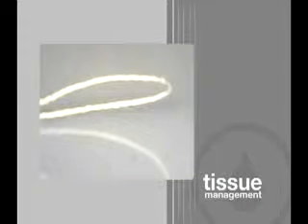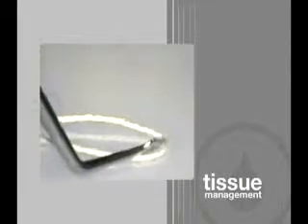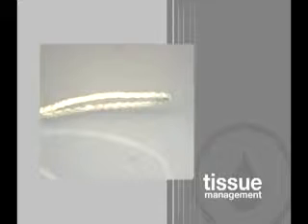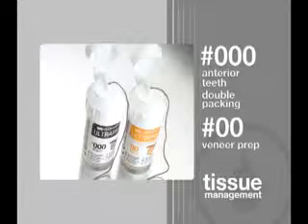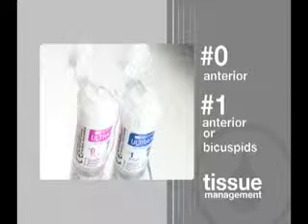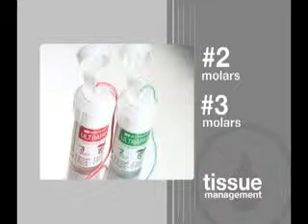Watch what happens when the ordinary braided cord is pushed down. It springs back up and returns to its original shape. But when the ULTRAPAK cord is pressed down, it stays. ULTRAPAK cords come in 6 convenient sizes. The cord size selected should be large enough to compensate for the compression of packing. However, tissue firmness and friability, as well as the amount of space desired, may require using different sizes.